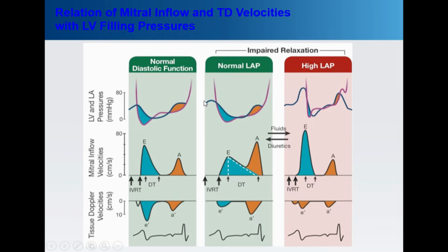With impaired relaxation, the ventricular pressure decays slower. So in early diastole, you have a higher ventricular diastolic pressure and a smaller gradient, and that's the inflow pattern you're all familiar with, with reduced early diastolic recoil. Because now the atrium, when it contracts, has more volume priming it to contract, so it has its own Frank-Starling. You get a more forceful atrial contraction, and that's the pattern that you see.